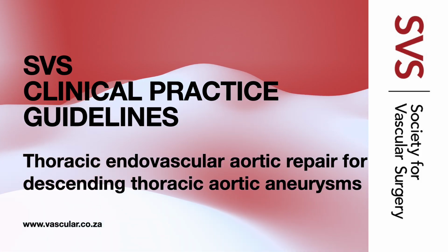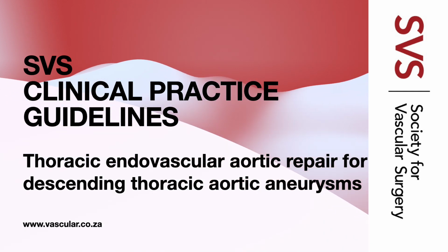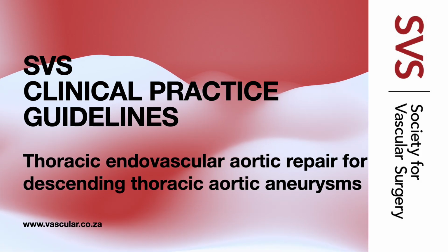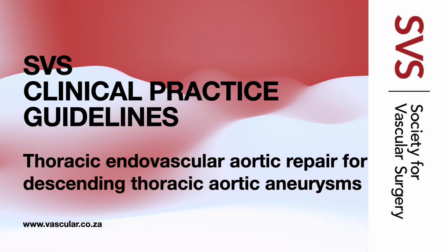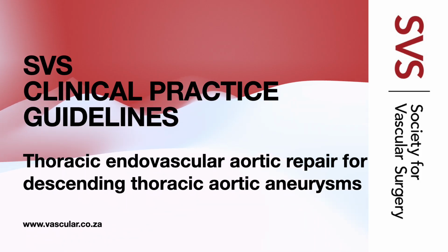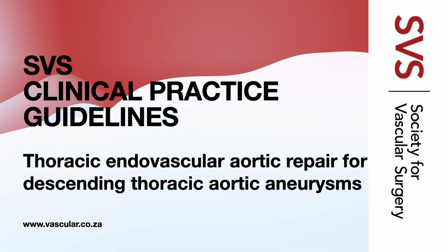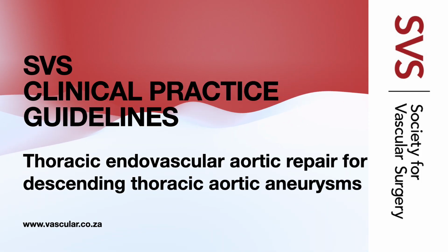It really is. And during the procedure itself, the team uses lots of protective strategies, too. Things like carefully managing your blood pressure, trying to use less X-ray dye to protect your kidneys, and special techniques if arteries going to important places, like your left arm or your gut, need to be covered by the graft. These are like built-in safety measures, backup plans. It sounds like TEVAR really is a significant step forward then. Yeah. A powerful, less invasive option for DTAA with some real benefits over the older surgeries. Definitely. Big advantages in recovery and fewer complications for many.